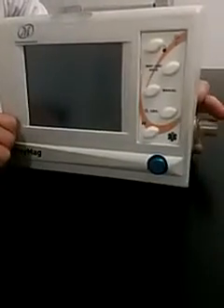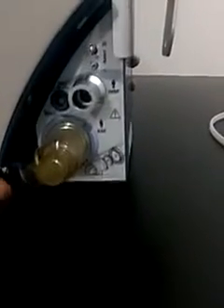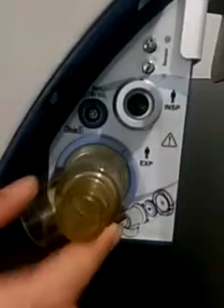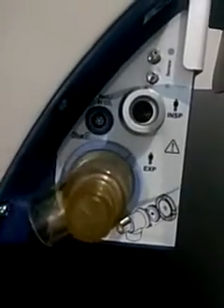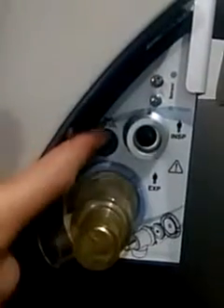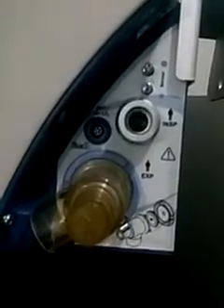Firstly, I'm going to show you the parts of Oxymag. Here from the left side of the equipment we have the inspiration outlet and expiration. Here we have the exhalation valve with magnetic diaphragm, the connector for the flow sensor line, and optionally we have an ETCO2 or SPO2 adapter.